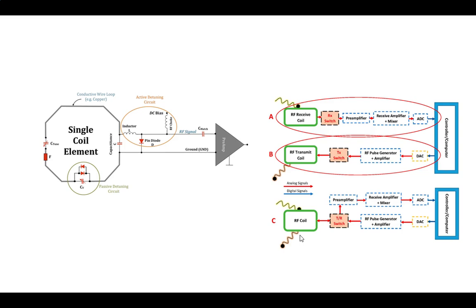So the rough equivalent I can make is, anybody ever see those little garden things that have little phosphorus bits on them, and they soak up light during the day and then they glow for a couple hours at night? That's kind of your difference here: the one doing the kick is like the sun, and that little phosphorus thing is like your body responding back. Just to give you a brightness differential between them.